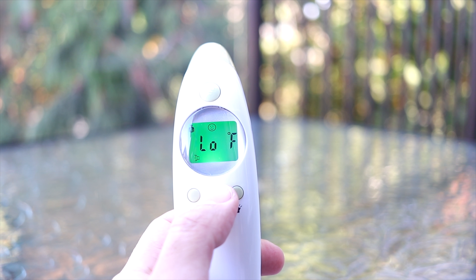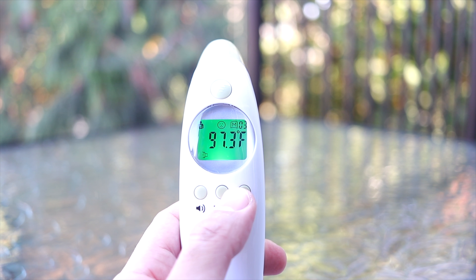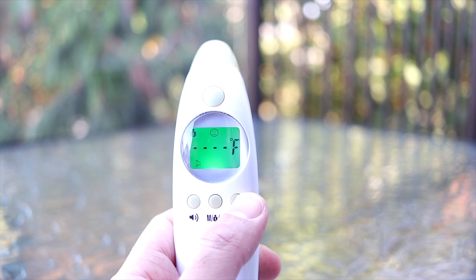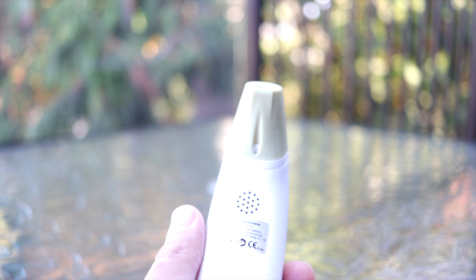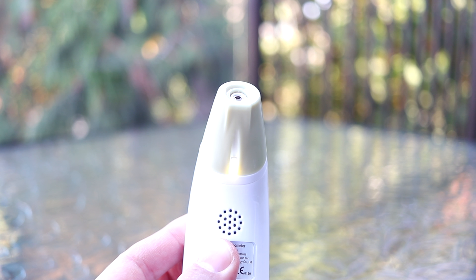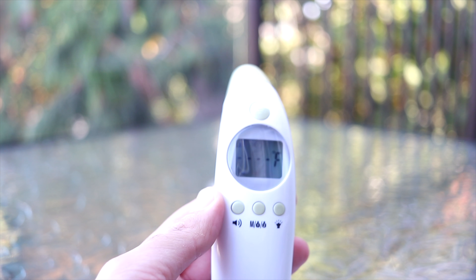Switch from forehead to ear detection mode through pushing the forehead cap — it's the easiest and most practical way to take temperature. The thermometer offers clinical accuracy and reliability, fast reading and memory storage, a backlit indication and flashlight, and different unit settings from Celsius and Fahrenheit.